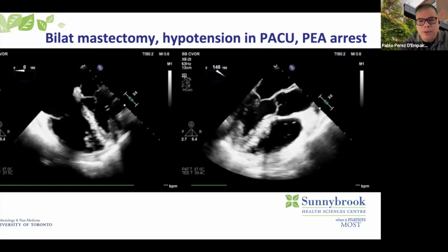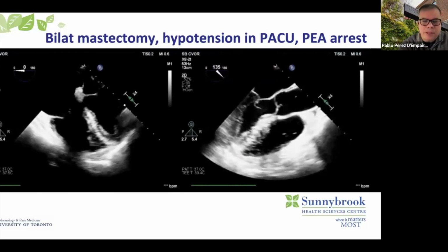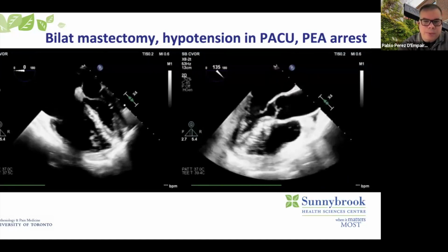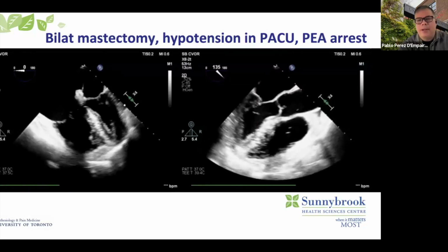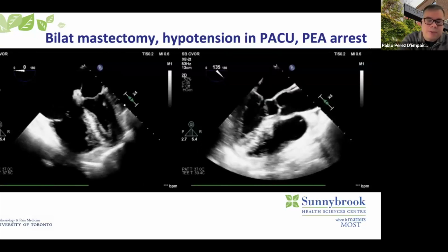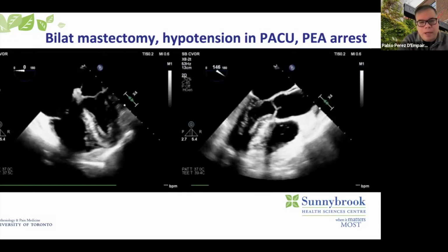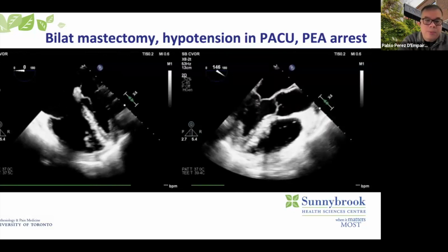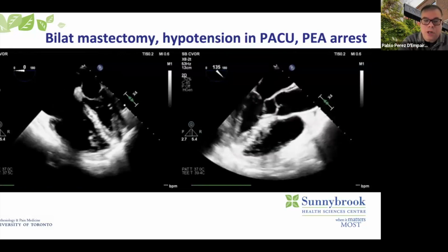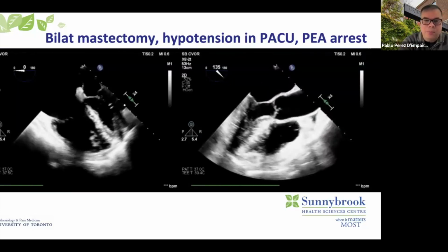Did not improve. Went into cardiac arrest, and after a few rounds of CPR, we tried to do transthoracic POCUS, but we couldn't really see much of a view. So we put a TEE probe, and we saw severe RV dysfunction with dilated RV and no other real causes of the arrest. So that led us to think that this could be explained because of a massive pulmonary embolism, which made us take the decision to give IV thrombolytic, which in another scenario would have been very challenging to decide, giving IV thrombolytic to somebody who is just coming out of a major surgical procedure, because obviously administering the thrombolytic is going to lead to bleeding.